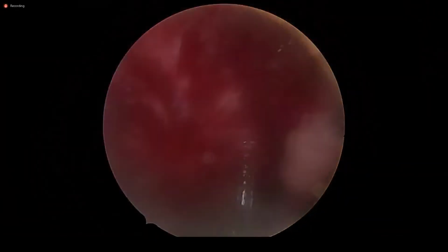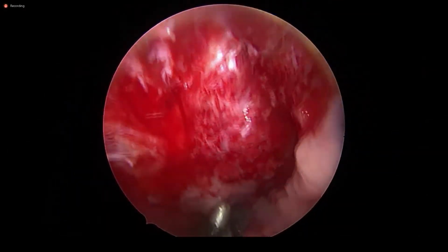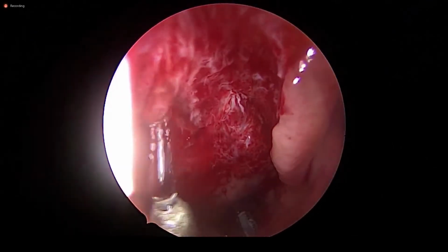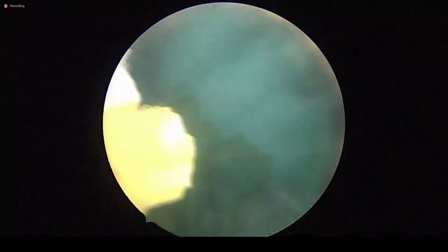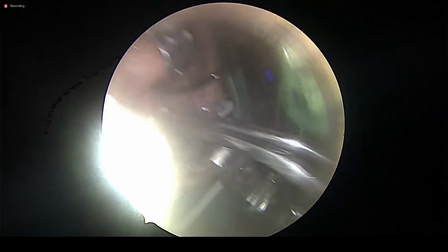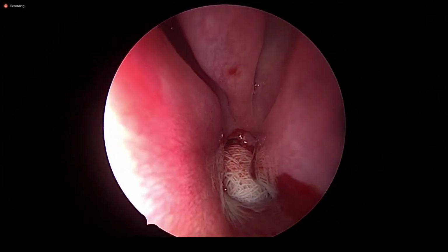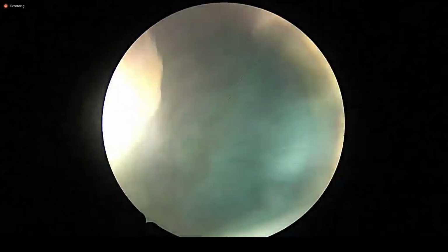See this? Yes, sir. Below is the mucosa and this is the perimysial plane. Little bit of oozing. I will take care. Now comes the role of the coagulator. Until now, I didn't use the coagulator for these regions. The reason is obvious, to prevent perimysium and the muscle being charred unnecessarily. That I would never want. That is not our target.